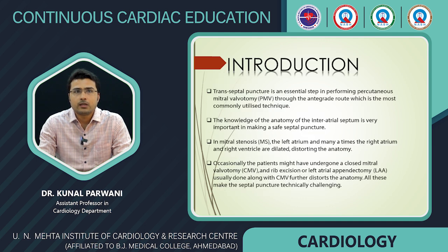Transseptal puncture is an essential step in performing a very important procedure called the balloon mitral valvotomy through the antegrade route, which is the most commonly utilized technique. And knowledge of the anatomy of the interatrial septum is very important in making a safe transseptal puncture.